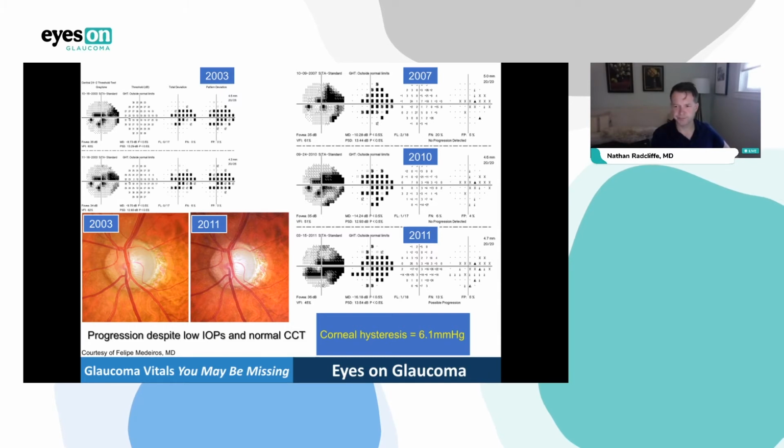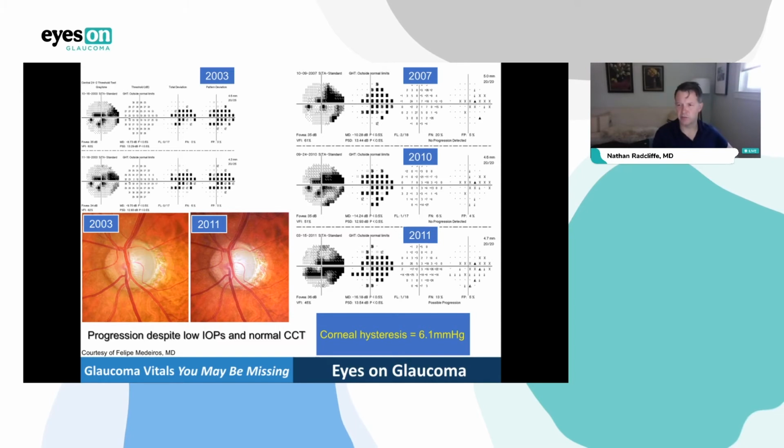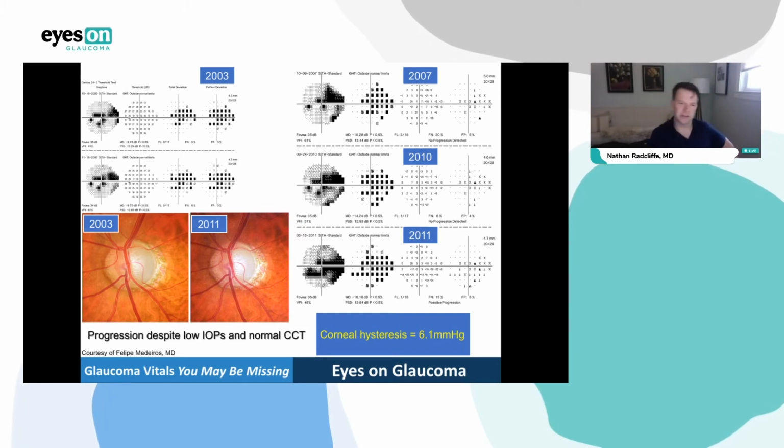So that's the sense there. We did get an audience question I thought I'd jump over to, which is, do you believe hysteresis is more important than corneal thickness? And I do, and I recognize that you're probably not going to get rid of your DGH pachymeter at this point in time. You need it for your cornea patients and all that.